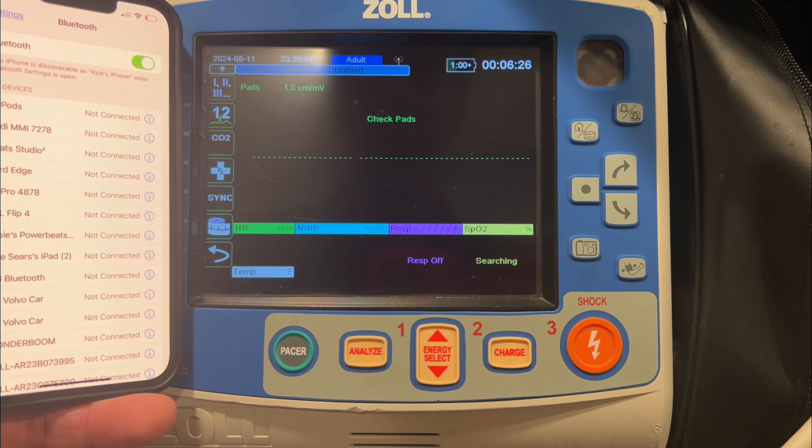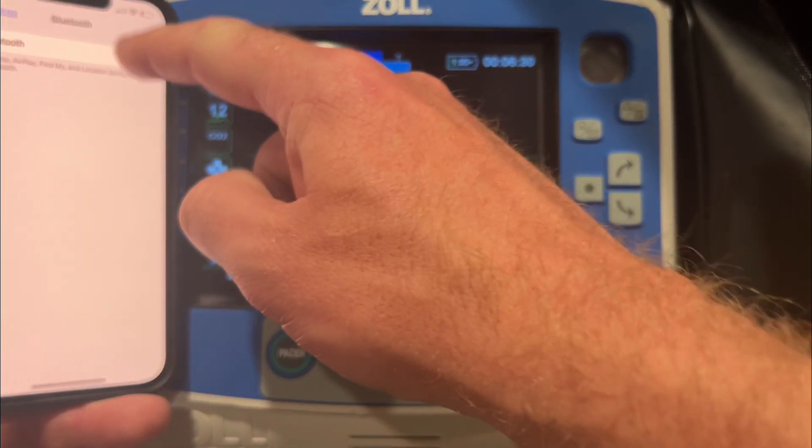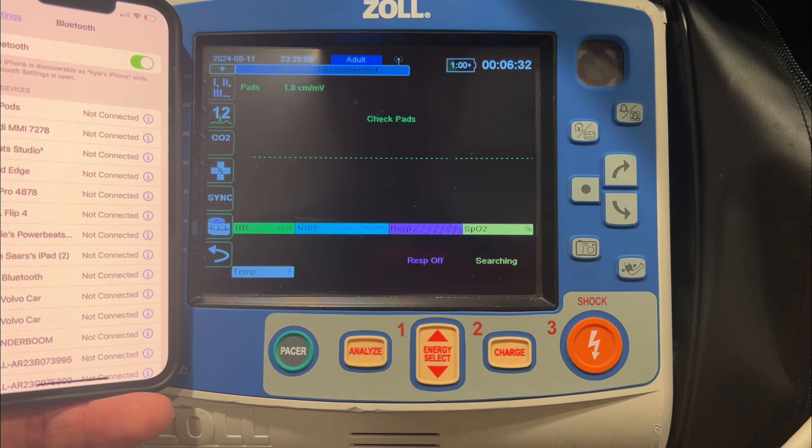Next, go to Bluetooth. Turn it off and then immediately turn it back on. That's going to make it discoverable so the monitor can see it.